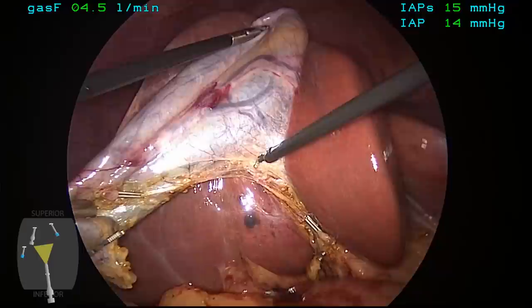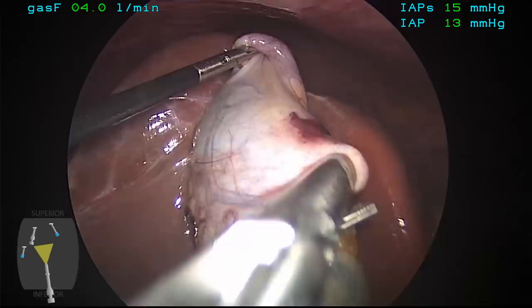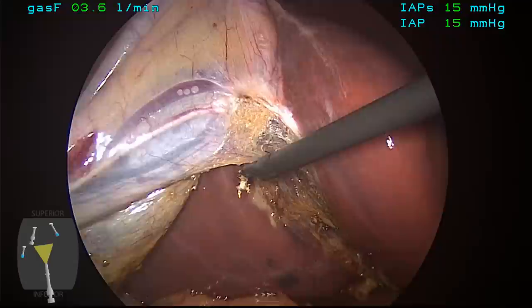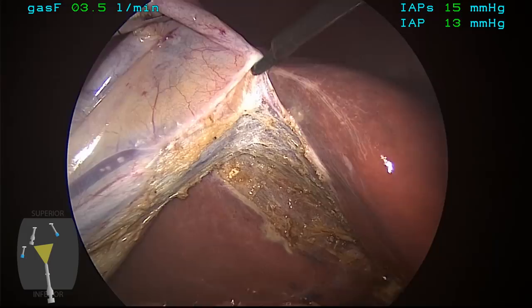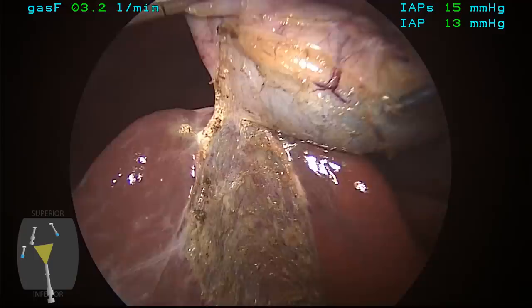The cystic duct has now been divided, and the last step in the operation is to detach the gallbladder from the liver bed. These peritoneal attachments are divided with the L-hook monopolar instrument using short bursts of energy, and this can be done either by basically painting these adhesions apart or elevating and dividing with the hook portion. It's important to flip the gallbladder back and forth, side to side, in order to optimize exposure and tension on the mesentery of the gallbladder to facilitate its division.